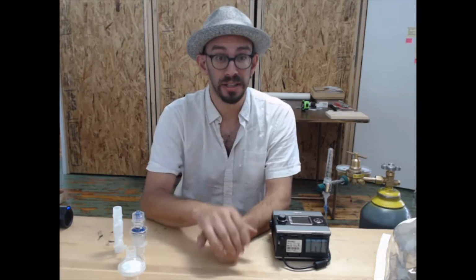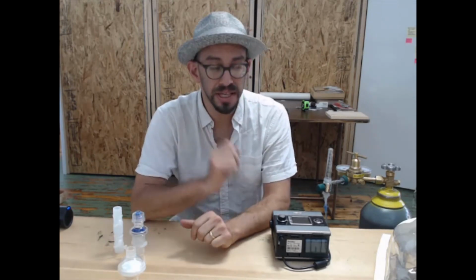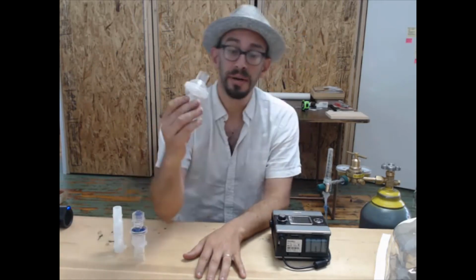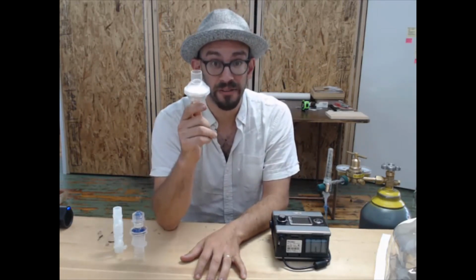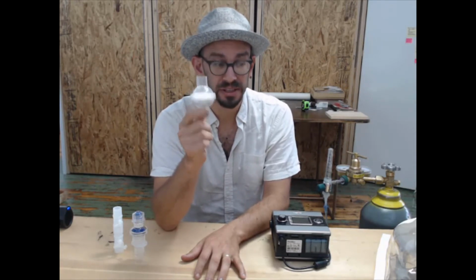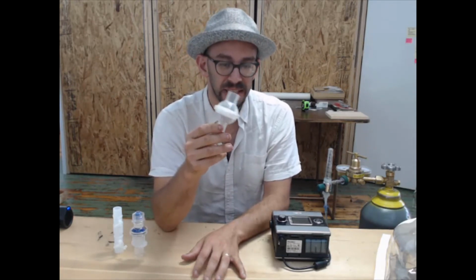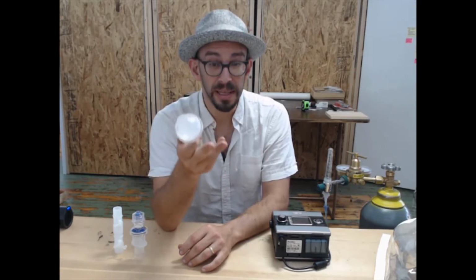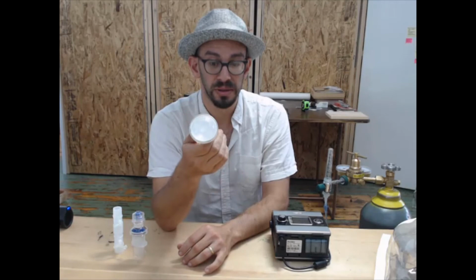I want to talk for a sec about the parts that aren't included in the circuit. There's two key things that you'll need a supply of in your hospital. One is the 22 millimeter filters. So these are the only disposable part of the circuit. These are important. This is the barrier that keeps your healthcare workers from being exposed to a virus.